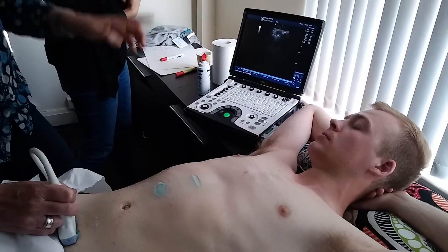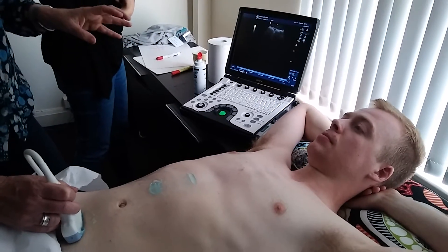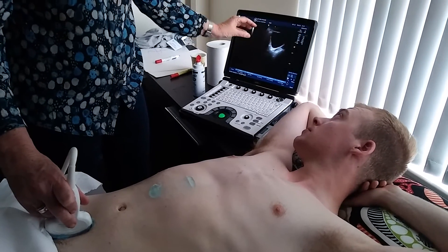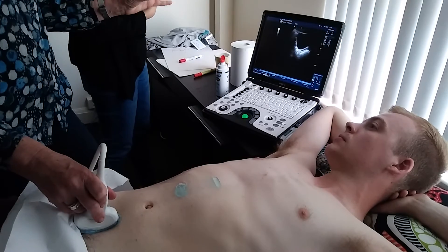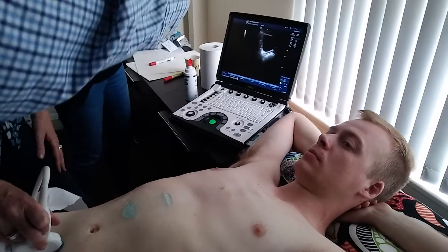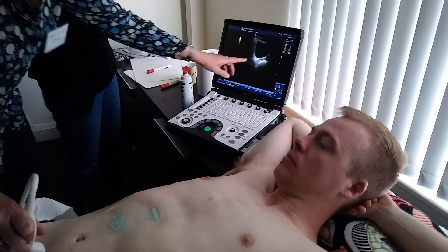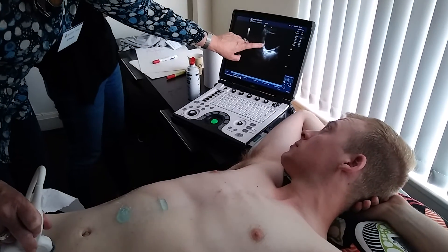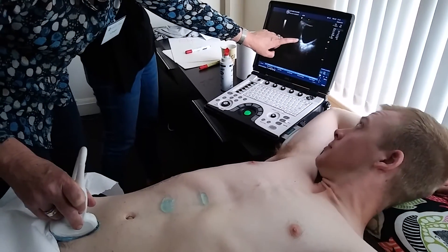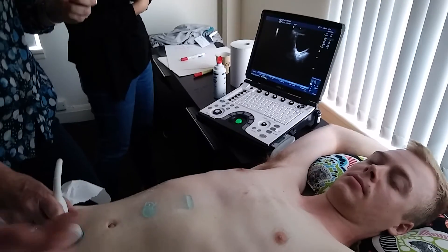When I hit the top of the bladder, I would scan higher just to make sure there wasn't a pool of fluid outlining the bowel on its way down. That's why I tend to go longitudinal - because it's giving me a historical representation of the pathway of the fluid in one snapshot. So in that view, if there was fluid behind the bladder, you would see like an arc of darkness - like a black arc with a white line representing the bladder wall. Correct. So there'd be black, white bladder wall, then black. And it would take on the contour of the bladder wall on this side and the contour of the bowel outline on the other side.